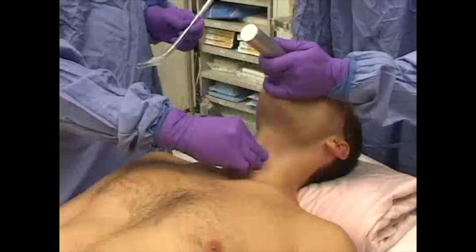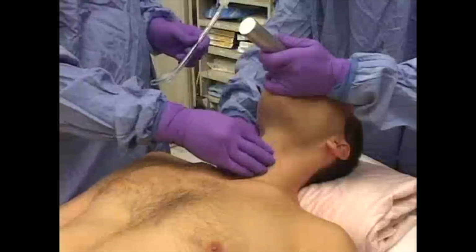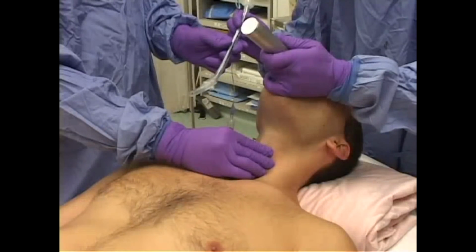Fine movements of the blade tip at the vallecula and subtle changes in pressure and direction of force can cause dramatic differences in laryngeal exposure. Bimanual laryngoscopy is about connecting these fine movements at the anterior neck with direct observation of laryngeal view. After the view has been optimized by the laryngoscopist, an assistant can transiently maintain external manipulation at this location, freeing the laryngoscopist's right hand to place the tracheal tube.